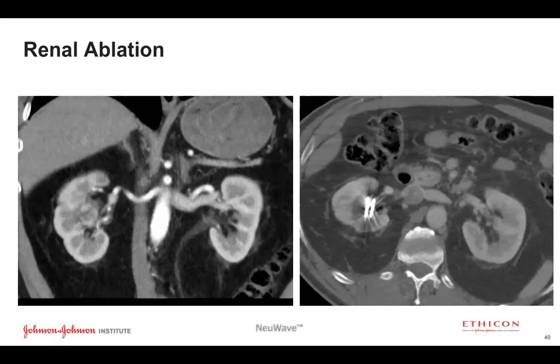The other thing to consider with central renal tumors is something called pyeloperfusion, which is an advanced technique where you need your colleagues in urology to help you. Basically, through a ureteral catheter, you provide perfusion into the renal collecting system with cooled saline, and that helps protect the renal pelvis and the ureter from injury. And actually, you can treat lesions that directly abut the ureter in that situation and be as aggressive as you need to be without worrying about injury or stricture to the ureter.